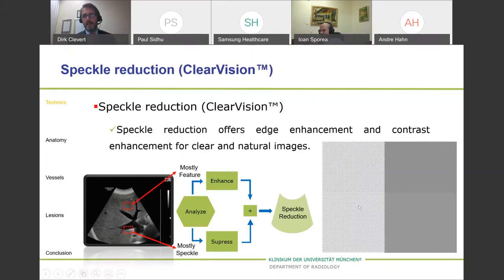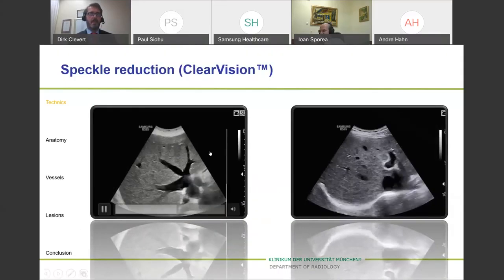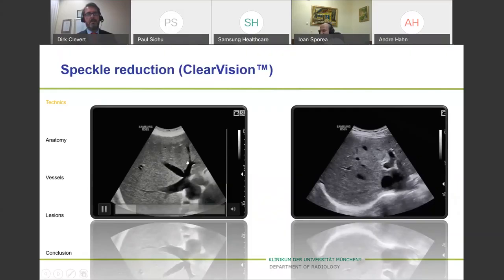And these are exactly the tints from the small spots here. So you see this technique looks at the structures for different dots. If the dots have the same tint, they summarize a couple of dots and you get a bigger dot in the tint. So you see it's getting more like an MRI. It's more gray, more uniform, and also more dark, because these dark speckles are summarized in this area.